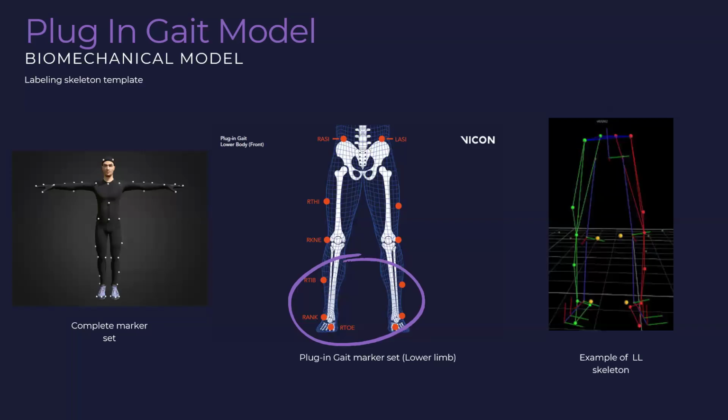The same way as I'm doing now, like applying, for example, pressure with the, like I would need to, maybe not. But yeah, I need a synchronization step. So I would apply pressure on my heel and then I will recognize the pattern, because I'm not directly using the Vicon data to feed my exo algorithm. So I don't need it to be synchronized directly. I can do it in post-processing.